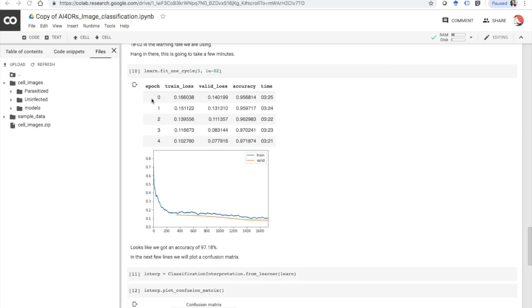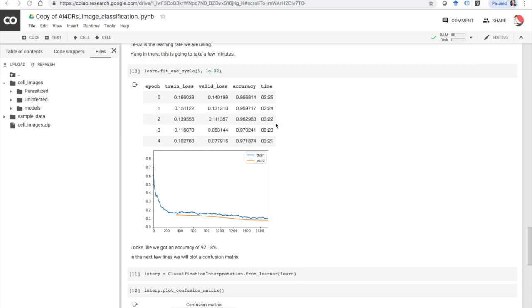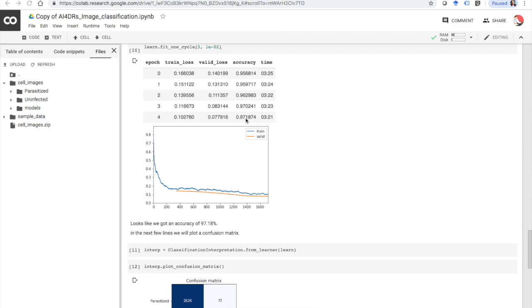The training has finished. As you can see, we have gone through the whole data five times and got a pretty decent accuracy of 97.187%. Here we can see the graph that plots the training loss and validation loss. As a rule of thumb, your model is good if the training loss is slightly lower than or similar to the validation loss. But if the training loss is much lower, your model is overfitting. There are arguments that if accuracy is still improving the model is getting better. Just by five iterations we got an accuracy of 97.18%.